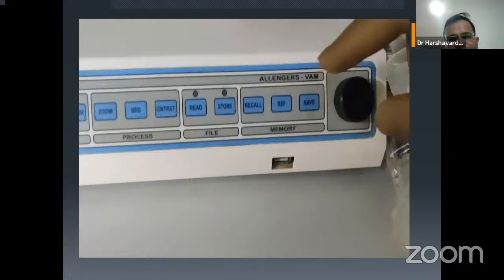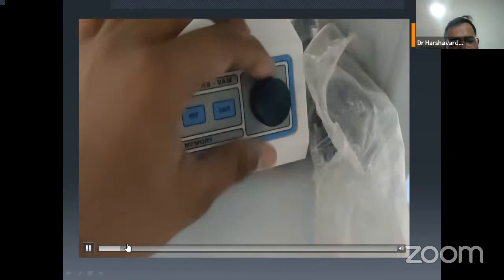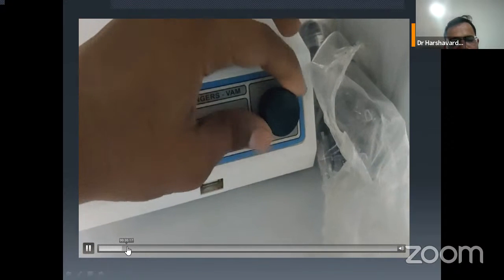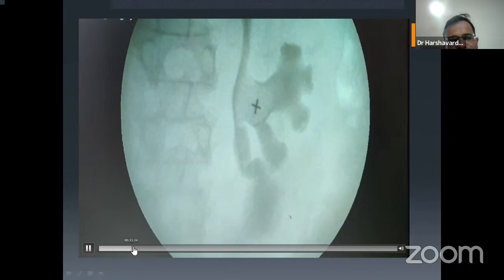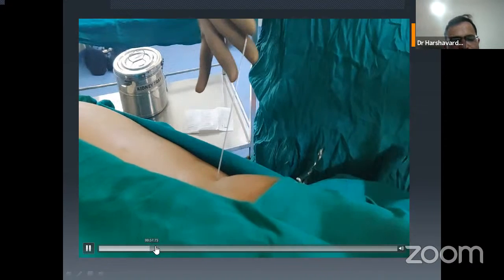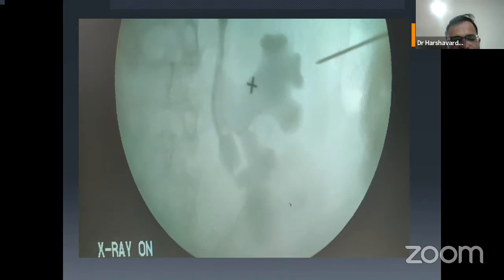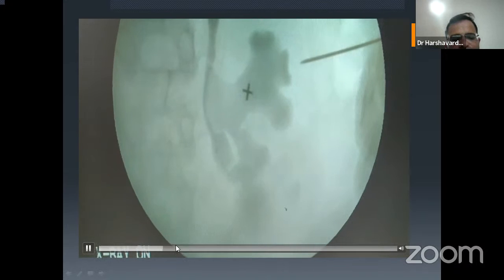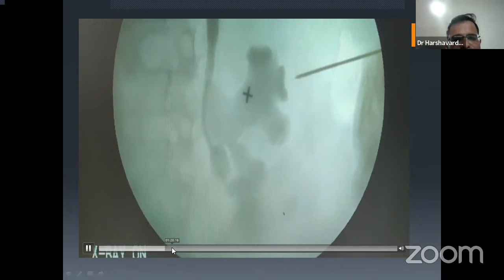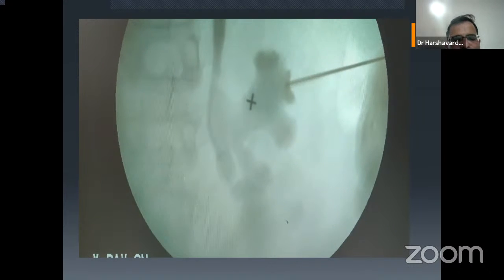See, the C-arm button has malfunctioned. I cannot rotate the image. I'm not able to rotate the button. We tried everything, but the patient was there prone. We made the patient prone. We first tried the inferior calyx, but again orienting 30 degrees towards the skin surface, we tried to hit the middle calyx, because the middle calyceal orientation won't change even though the image is upside down.